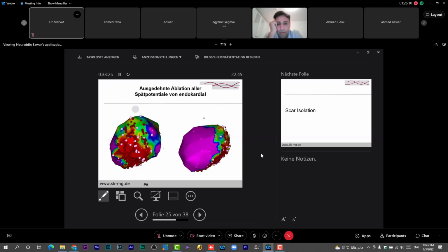You're right. HD grid I have used many times and it gives me maybe shortening of the time, but not so much shortened if you are not accustomed to it. Sometimes you need to do remapping with point-to-point mapping after using HD grid to be accurate about the points that have been taken, or acquired. I think this is also like confirming what has been done with the HD grid, for example.